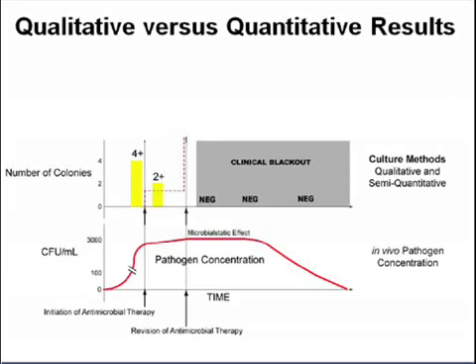Well, now building upon this with the detection method that is generally accepted as the only method for determining if a patient has bacteremia. This is culture. Culture methods are generally qualitative in nature. In some cases, they may be semi-quantitative, where they report back 1+, 2+, 3+, or 4+ organisms, as shown here. So essentially a yes or no response if the organisms are there or not.